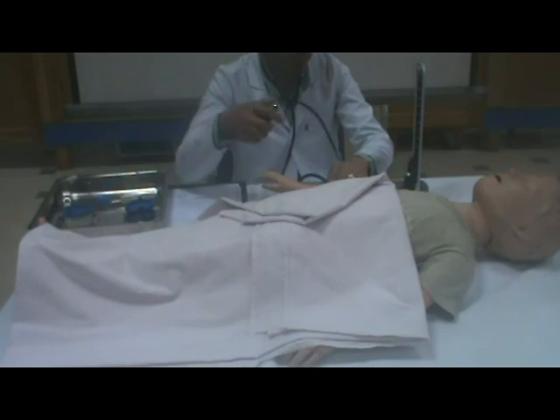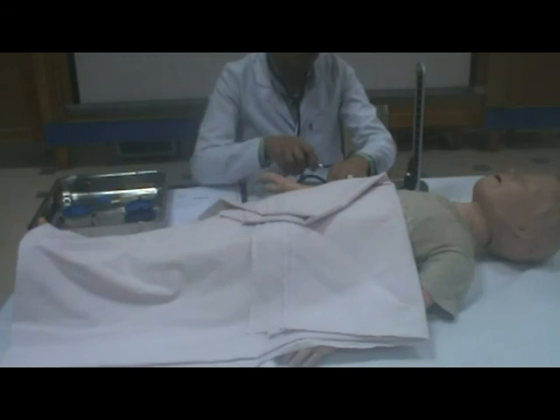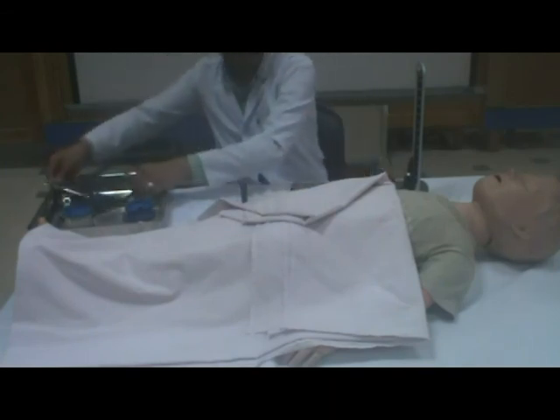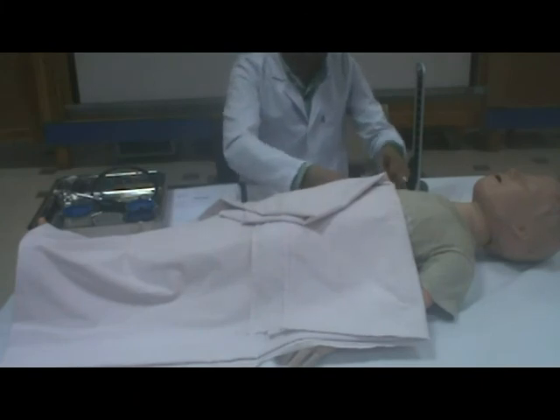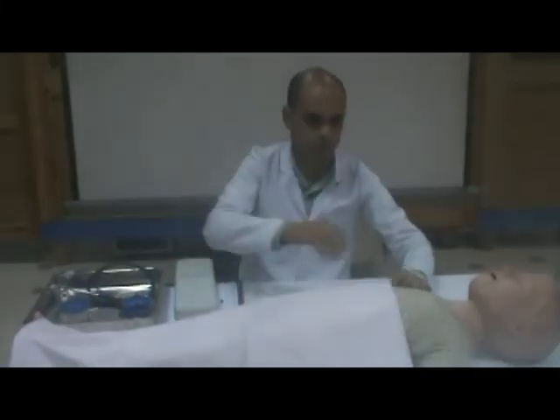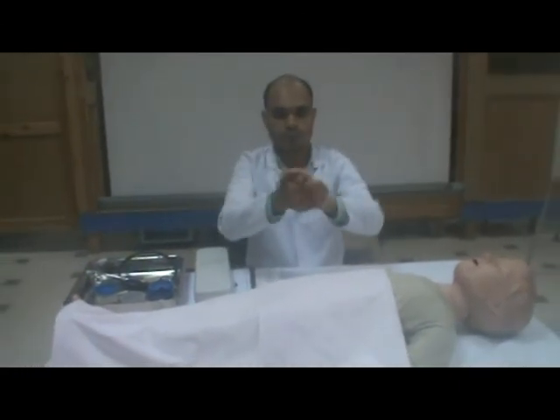Slowly deflate the cuff. Note when the pulse is first heard, systolic pressure, and when the sound becomes muffled or disappears, diastolic pressure. Remove equipment. Hand washing. Record your observation.